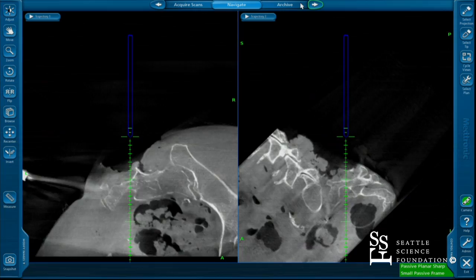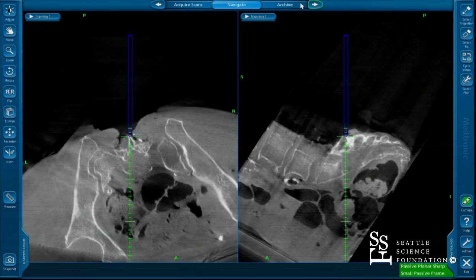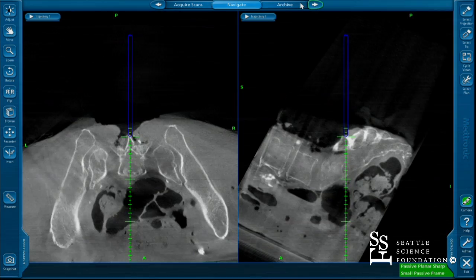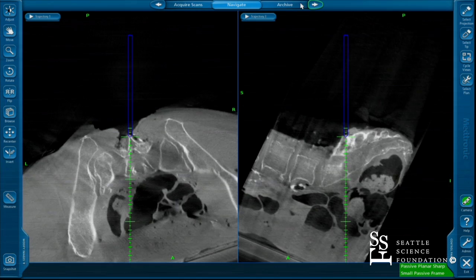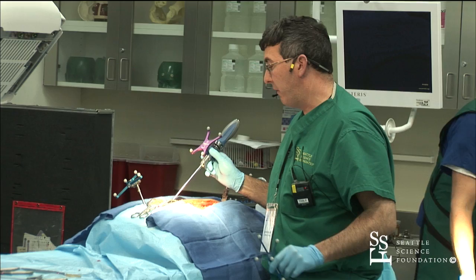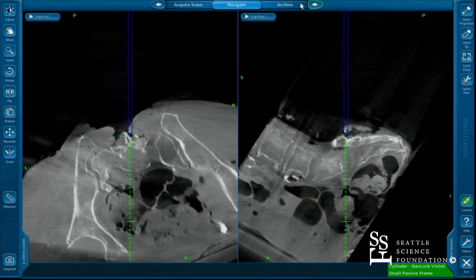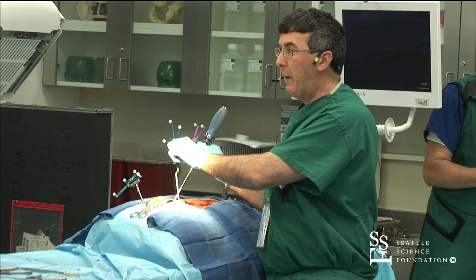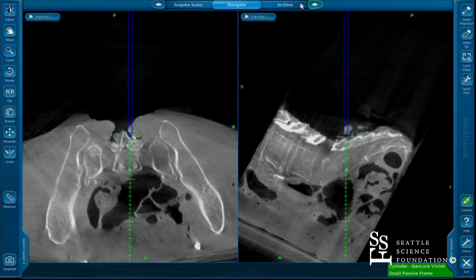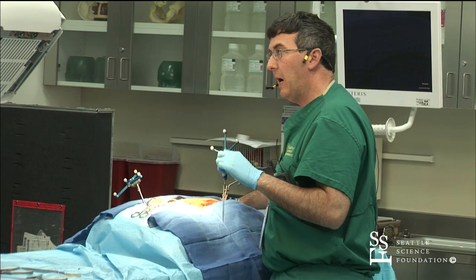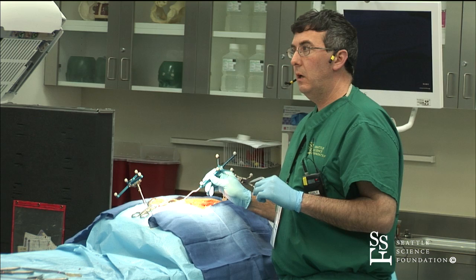So for example in this patient, I'd say okay, I want to make sure that I am on the top of the S1 spinous process. So here you go — I know just from my surgical anatomy that this should be the S1 spinous process. So when you see the computer screen, you can see the point — the blue tip is this marker. Now each marker is verified ahead of time because you're going to notice there are different instrumentations. This probe here is a different length than this probe, and so they're all reference-framed off. One of the other tricks to remember is the computer is only as smart as you are. So when you're passing different instrumentations in, it tries to read different systems and gets confused. So you always have to make sure you're only using one image guidance system and hide the other ones. So again, I'm pretty much know where I am — this is your S1 foramen, you can see that I'm in the S1 foramen.